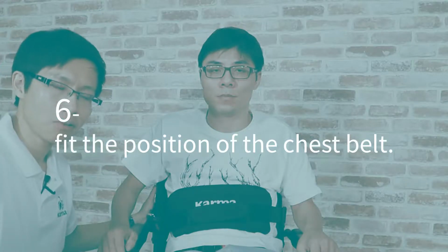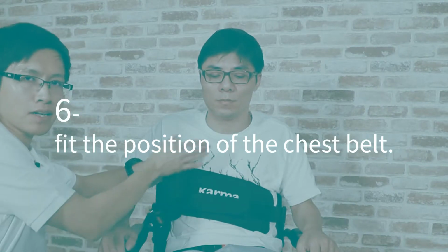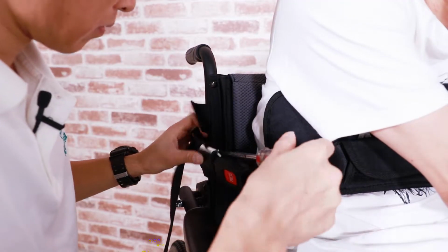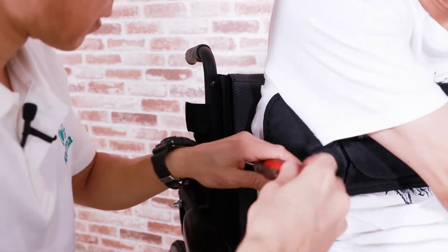The last stage of fitting is the position of the chest belt. For a user who has weak trunk control, we need to make sure that the chest belt is nicely secured. Otherwise, he might lean forward while standing up. Now, what is the right chest belt position? We draw a line between the 2 nipples like this. We can see the current belt position is obviously too low and cannot support the chest. Since everyone has a different height, we use this bolt to adjust the height of the chest belt.